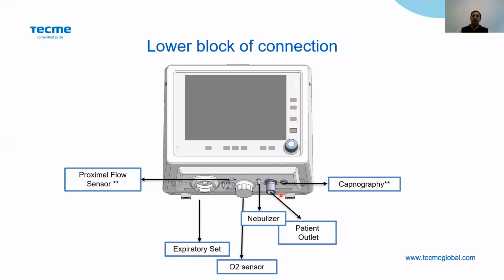And then in the GraphNet Advanced, we will find the capnography. Here we are going to be able to plug our Capnostat 5 from Respironics in order to monitor the volumetric capnography. All Advanced machines have this volumetric capnography included. The only optional item is the sensor. The software and the connection are already installed in all machines.